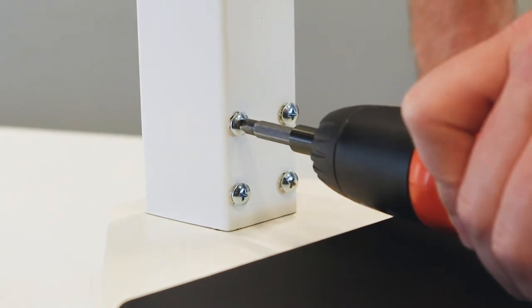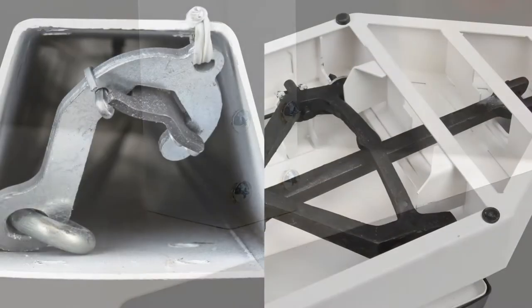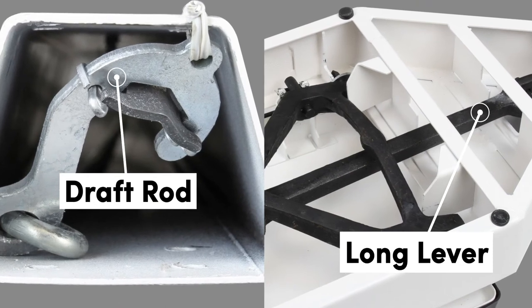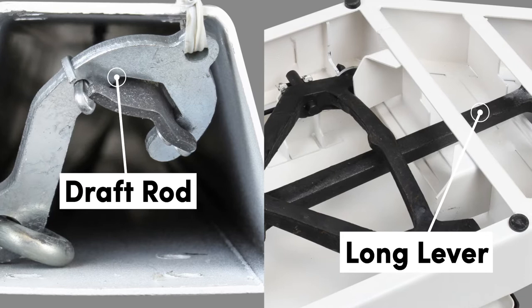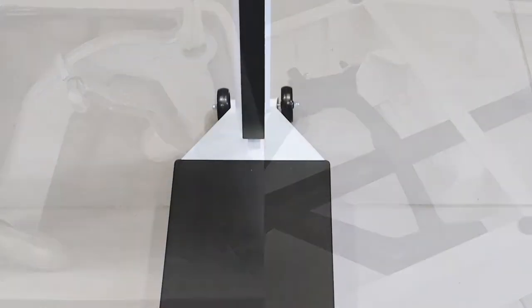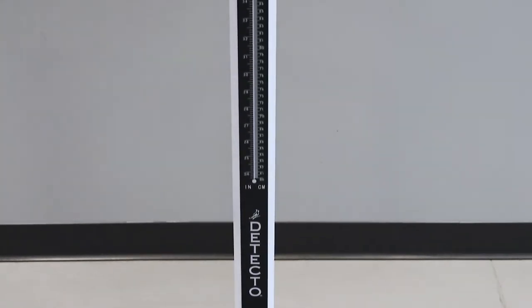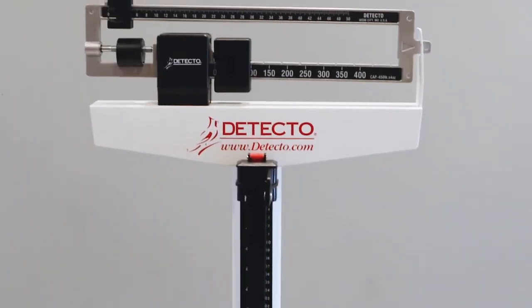Once the column is attached to the scale base, the draft rod located inside the scale column must be attached to the long lever in the scale base. The draft rod is what connects the way beam on top to the scale base down below and transfers pressure when weight is on the scale up the column to the beam for measurement.